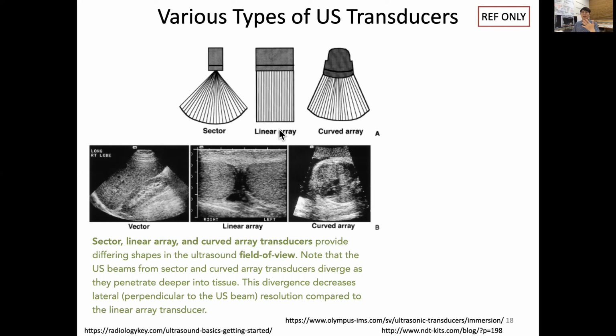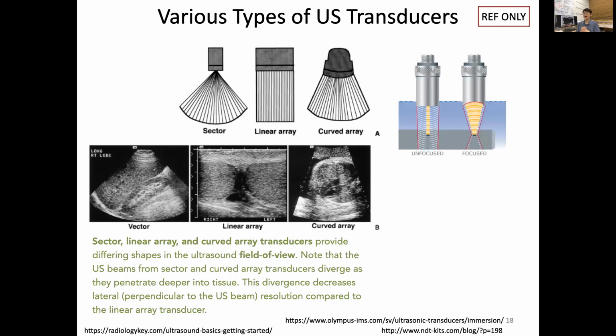So that's why in some cases we use a linear array, so that we don't compromise the spatial resolution. And the other thing I mentioned before is that we can sometimes utilize ultrasonic energy for, let's say, ablating kidney stones. Those are very important, another aspect where it's not imaging, it's more for therapy. So we can design the transducer shape as a curved concave shape so that we can make a focused ultrasound.